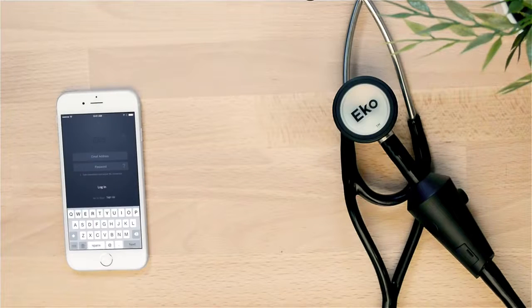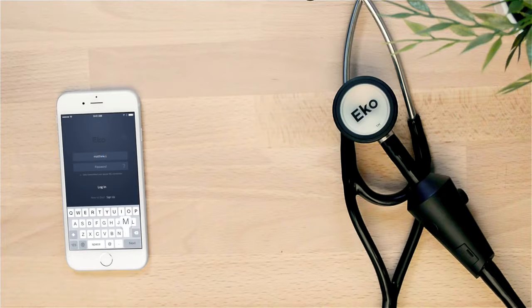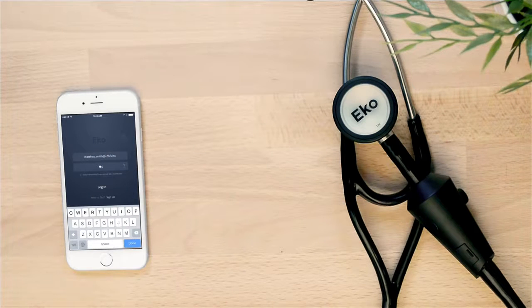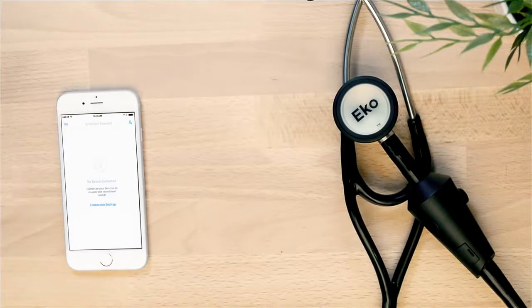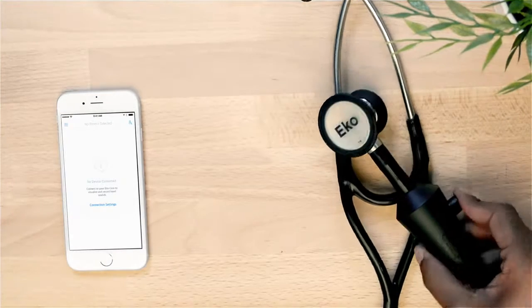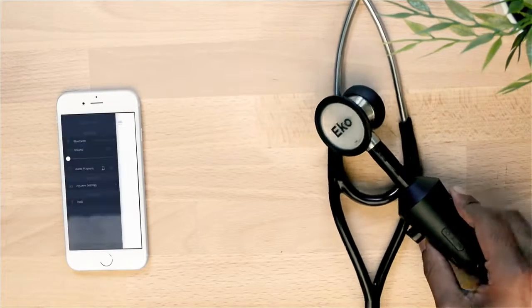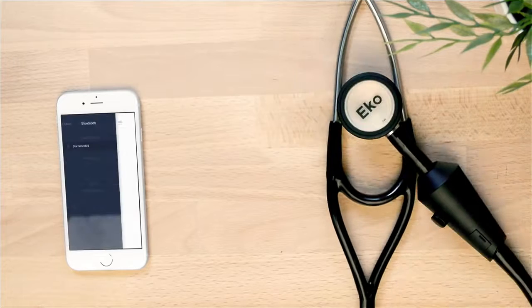We can start by logging in to the mobile application, which can be downloaded through the Apple App Store. The first thing you'll do is pair your mobile device to your Eko Core.